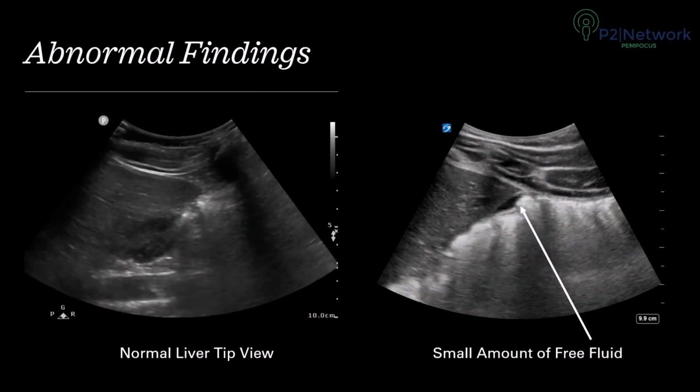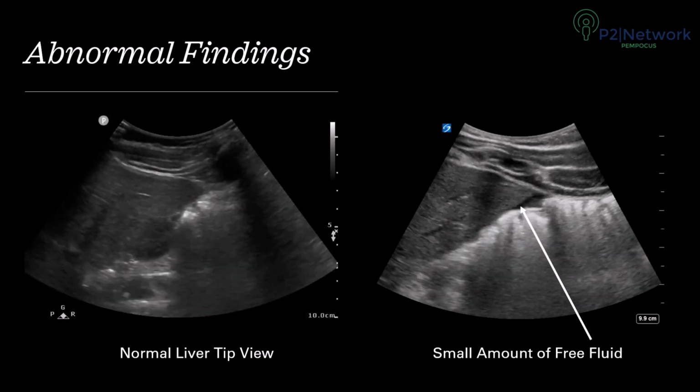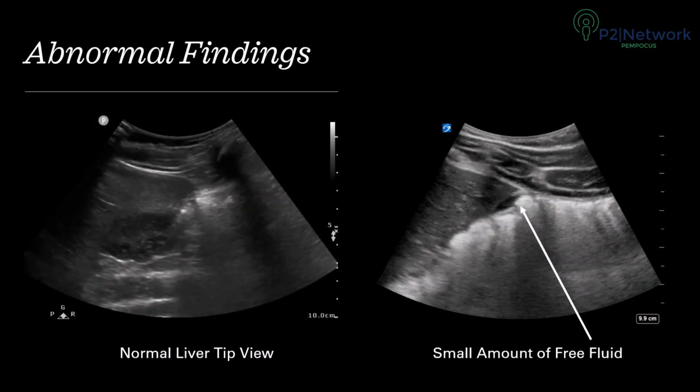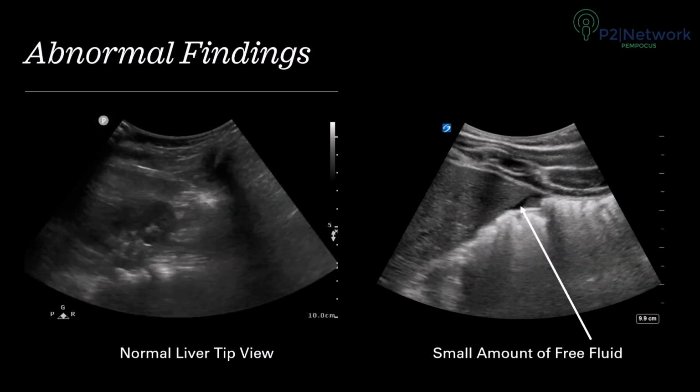Here is a more close-up view of the tip of the liver, and you can always feel comfortable changing your depth in order to get a better look at the tip of the liver, where here is shown some fluid only around the very tip.